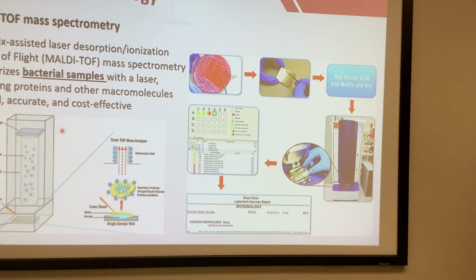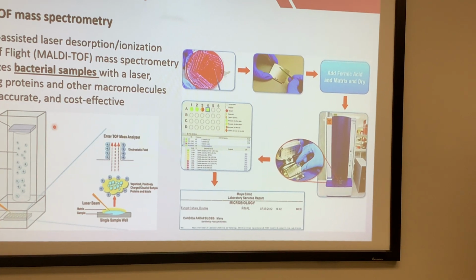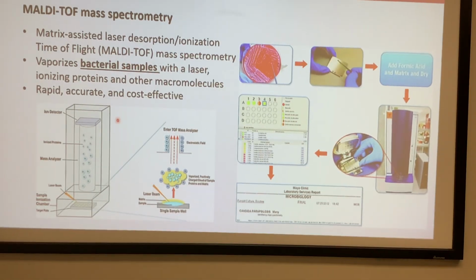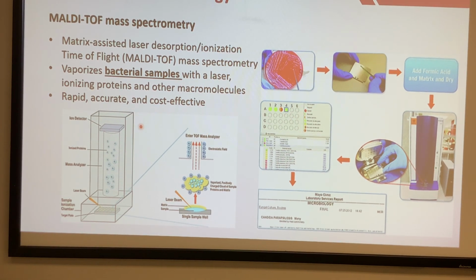I think it's also in your textbook. That is called MALDI-TOF mass spectrometry. So this is a trending technology in the microbiology lab, and actually, in my opinion, it's going to take the place of all of the previously introduced stuff in a short time, not right now. But anyway, the full name you do need to know: matrix assisted laser desorption ionization time of flight.